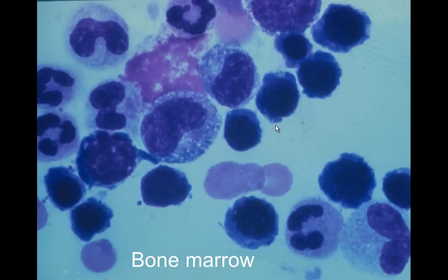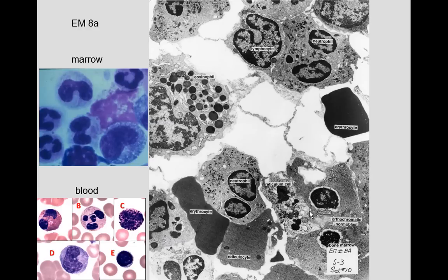Looking at bone marrow again, instead of looking for spherical nuclei, look for cells with oval nuclei — those are the ones that will become granulocytes. You can see an immature one here, a more mature one there, and progressively more mature forms, finally producing mature neutrophils.